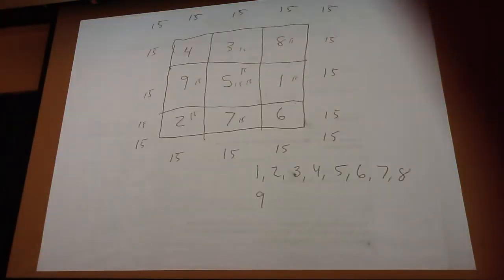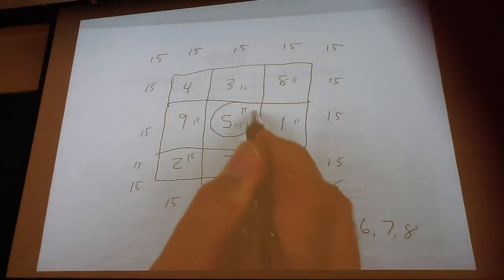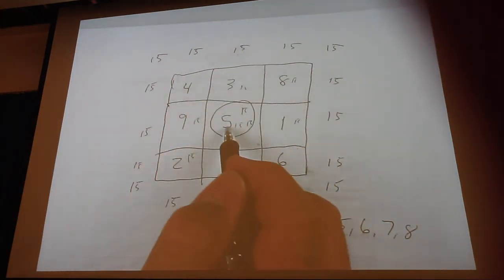Oops. Too much here. Okay, so with back projection, we would know that this one here is going to get a large number, but when I subtract 15 from the whole matrix, the only one that's going to have anything left will be this, right?